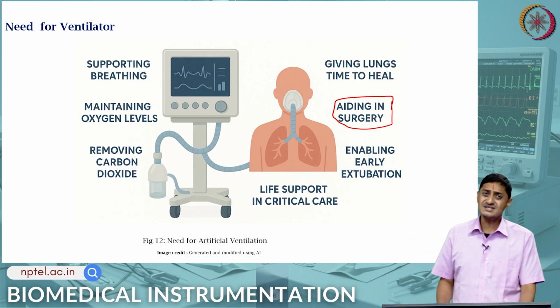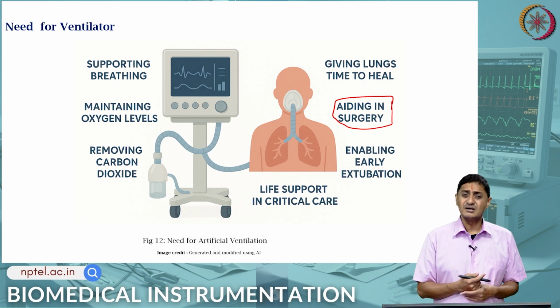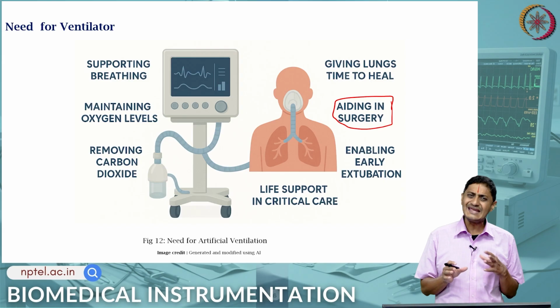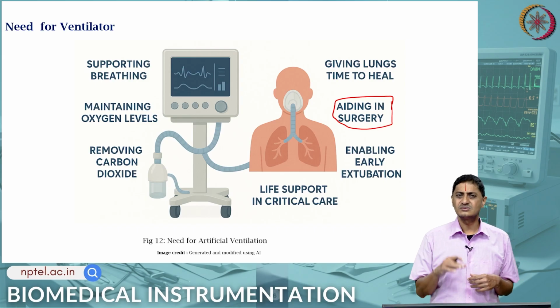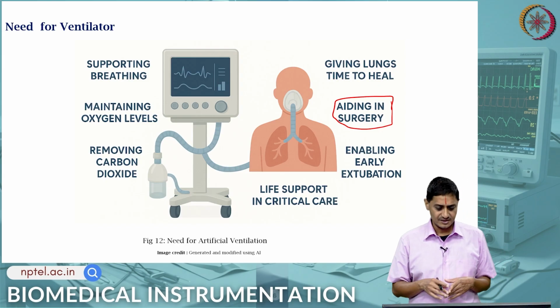The other case is a situation in which the lungs might be functioning, but you want to take some load off the lungs so that they can heal. Maybe they are injured too much. You want to give them some time to heal, so you support that. So, that is supporting.